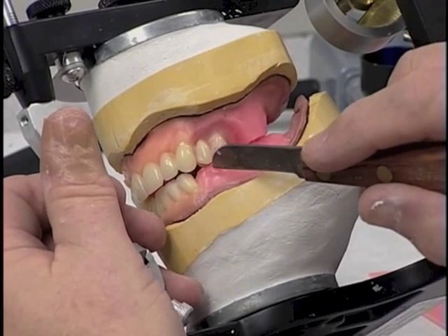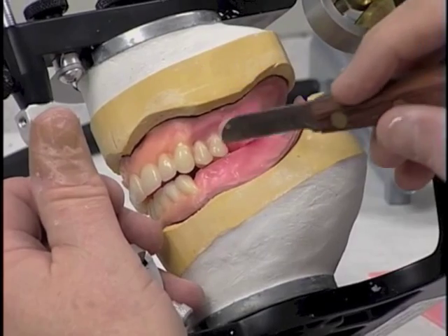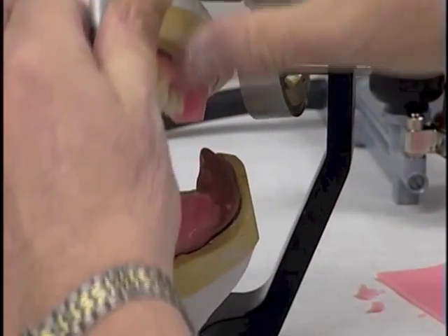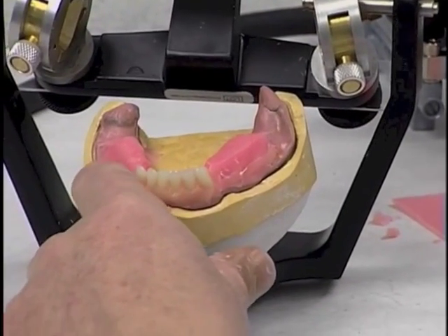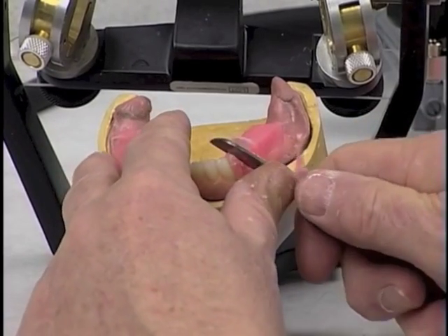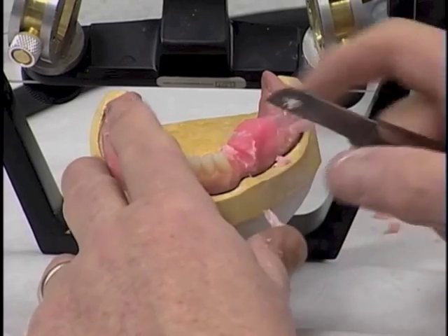So we're going to take some wax off of this lower, and we're going to arrange a mandibular second premolar now so that it articulates properly with the maxillary two premolars that we have already arranged.